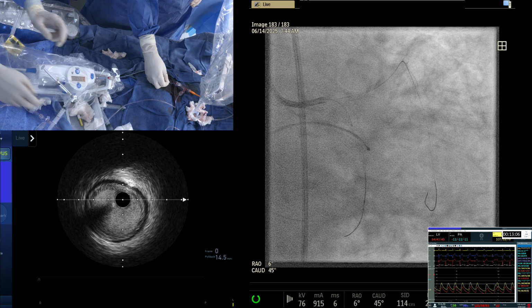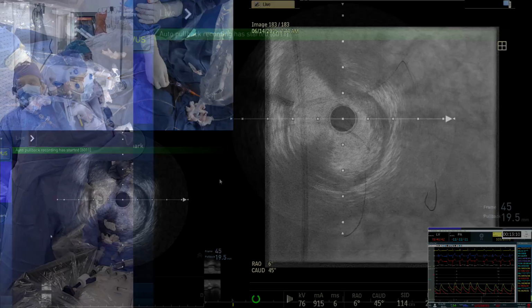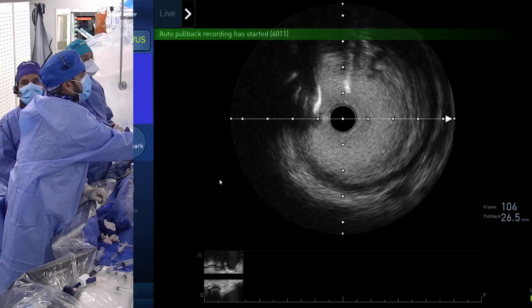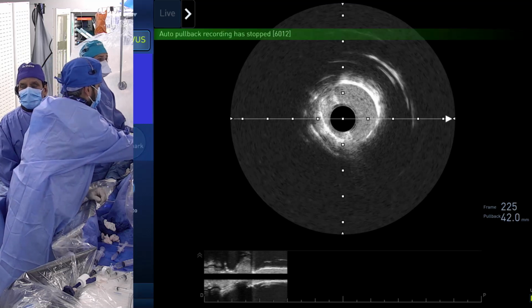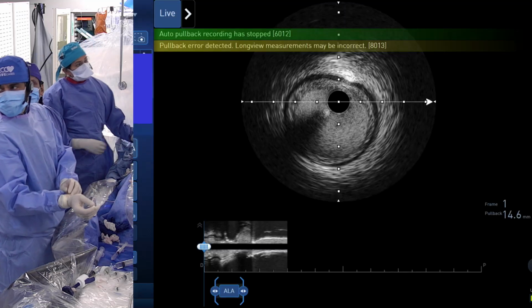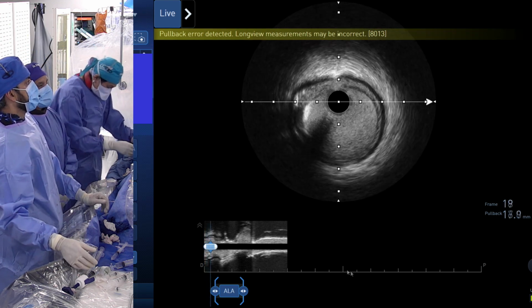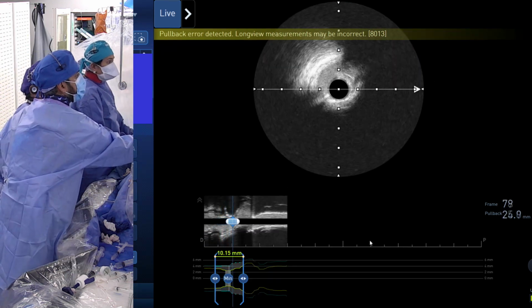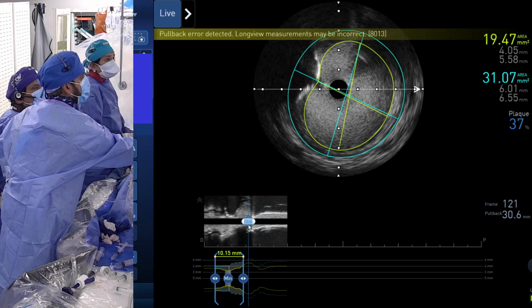Now you start live. Have this flush. Okay, make it on the main screen. Yeah, good. No significant disease. Still do it too fast. Okay, good. Down, stop. What is going on, guys? Make it 1. But anyway, you can see it now. That's the way we've been imaging. Do the manual imaging. It's 0.1 millimeter per second. I'm going to do it manually.